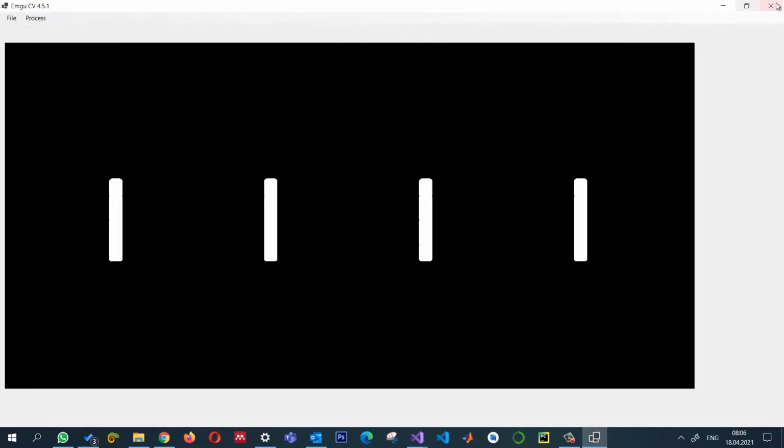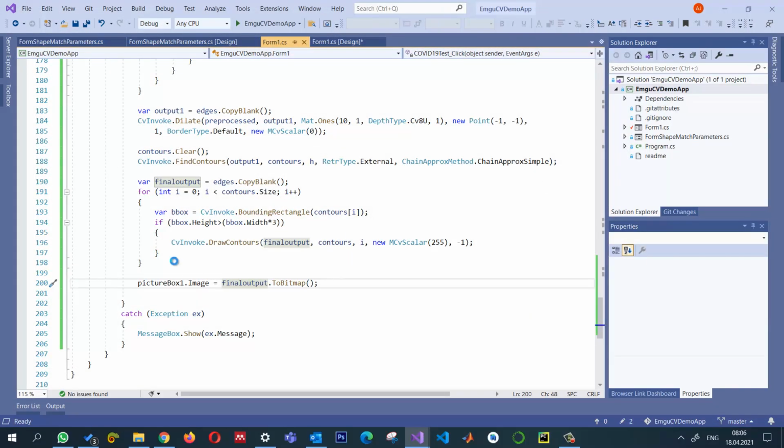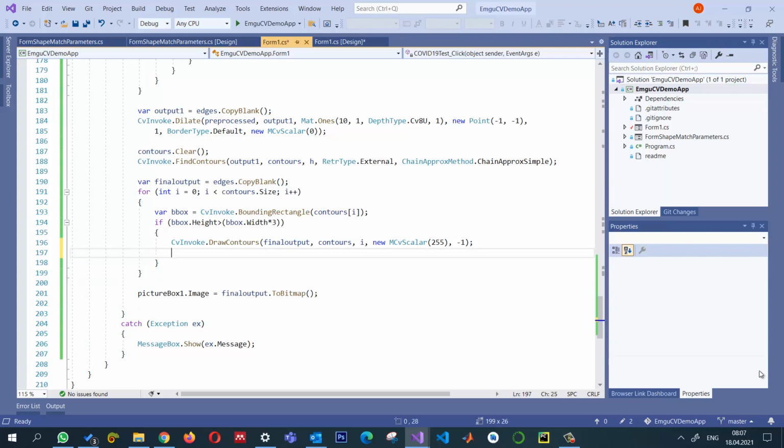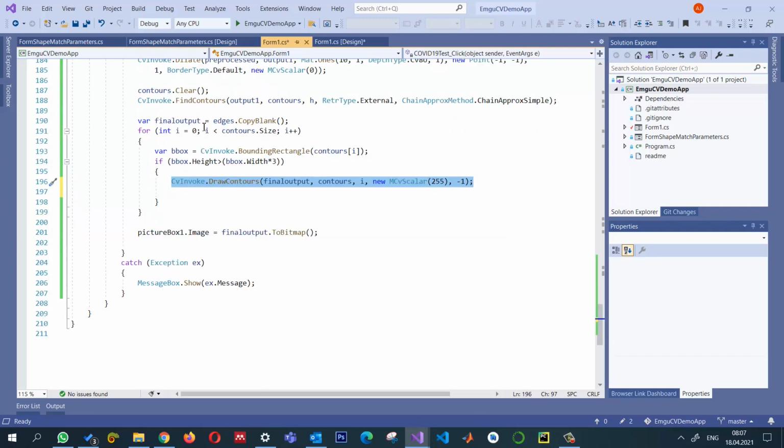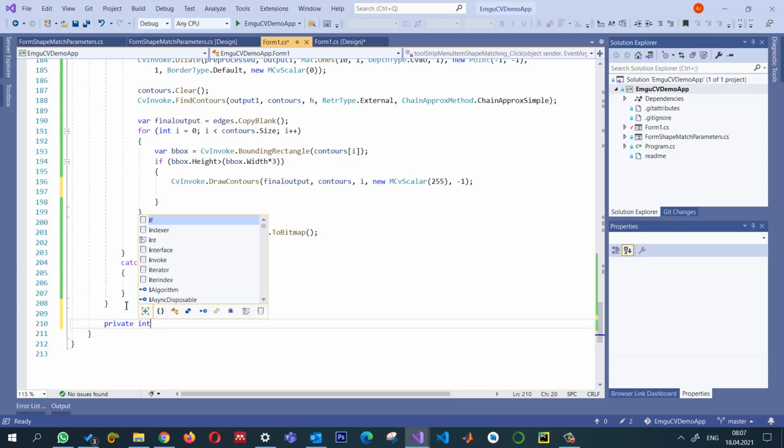So the interesting thing, we need to count the contours for each one of these. So what I am going to do is find the contours for each block. Since we have four contours, we can write a method and use it again and again. It is private, and this one will return the number of contours in it.